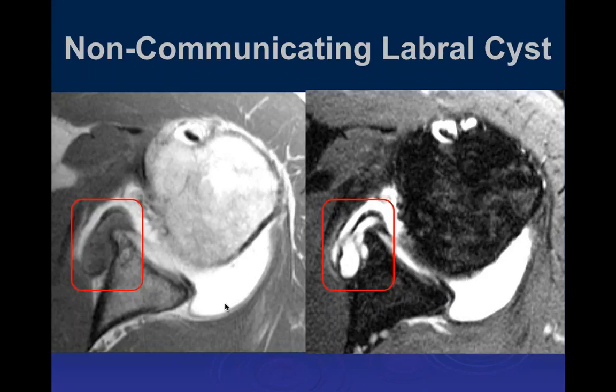And then if you call the patient and get them back in about 4 hours, the contrast will be about the right concentration. So in about 4 hours, you go from no dilution, or 1-to-1 dilution, down to about a 1 in 200 dilution. And then it's kind of exponential. So then it tails off, but usually 24 hours later, you won't see contrast in it.